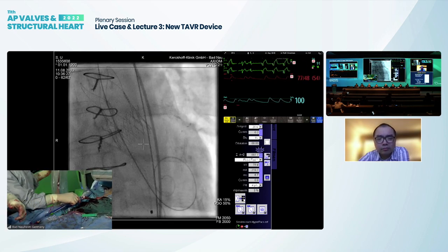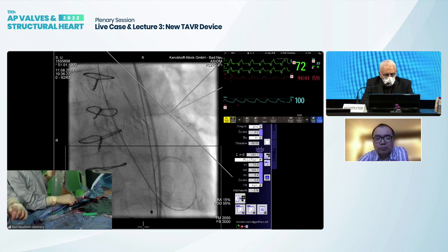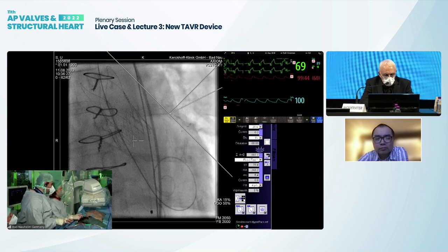Because then you're getting into a little bit more of a... I would try to post balloon it and hope that this is going to be better. Yes, exactly. Yeah.